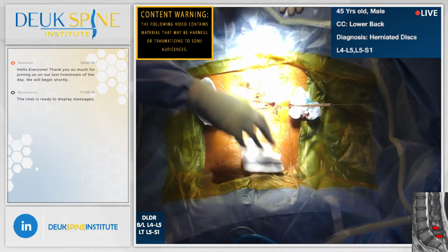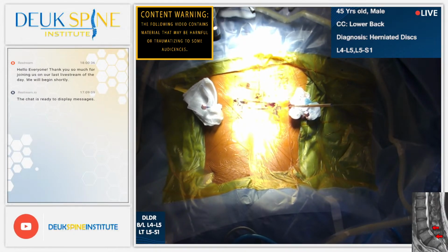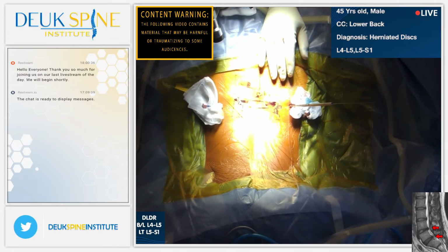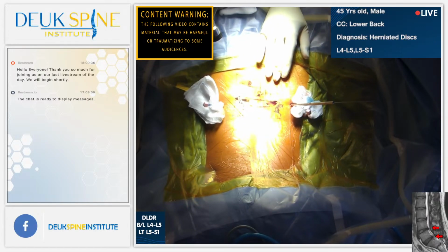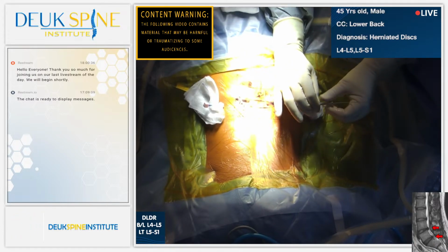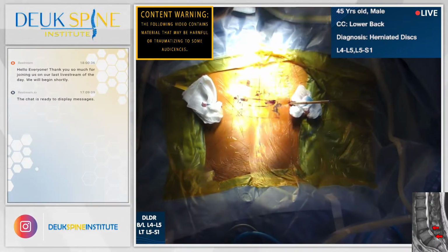All right, let's go ahead and show the audience how the Duke laser disc repair fixes back pain from a torn disc, a painful disc. Will you count out loud from 1 to 100? Keep counting. That's just medicine going in your arm. Keep counting. Playing educational video in 3, 2, 1.